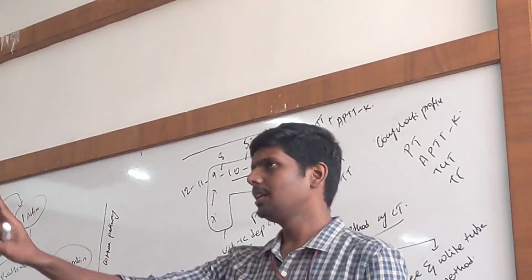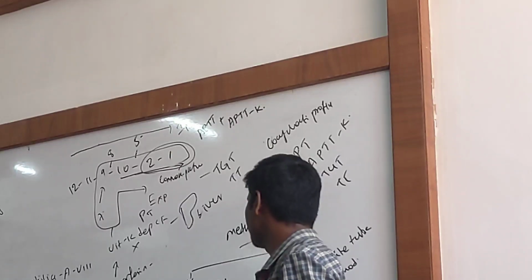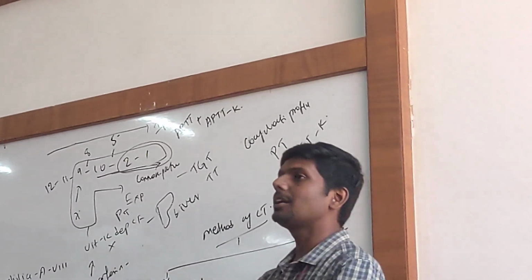Ideally, you need not break it every 30 seconds. Wait for 2 minutes. The normal clotting time is around 3 to 5 minutes. So after 2 minutes, you can start breaking.